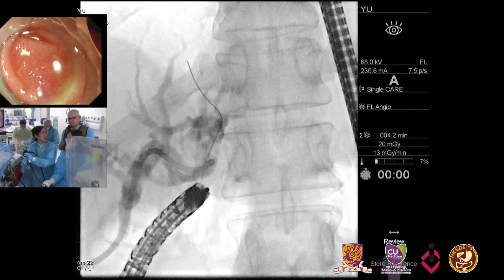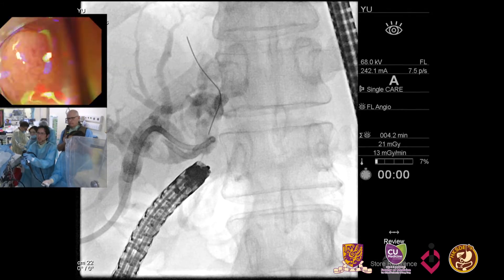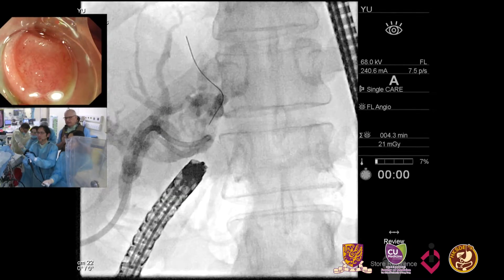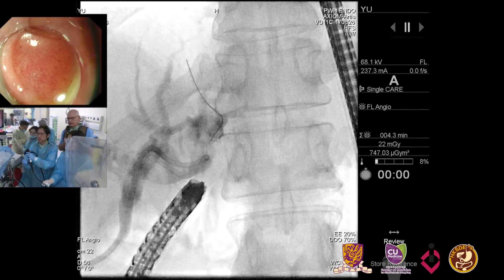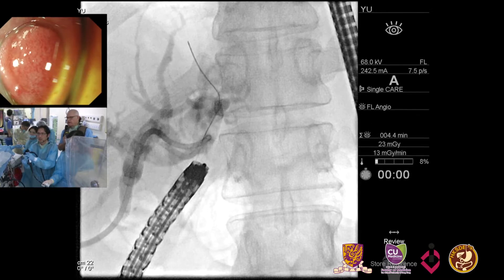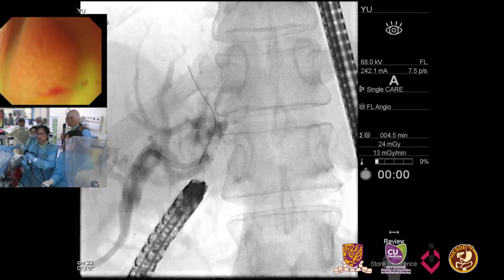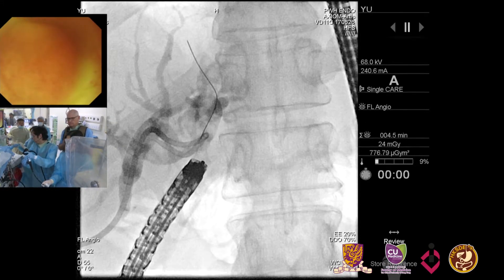How much can we dilate? That's always my question. You can certainly dilate to the diameter of the duct in which you're entering — at least you can try. I suspect there will be a lot of fibrosis, so whether or not we get a full dilation and make the waist disappear, I'm not sure. Let's exchange the balloon now.